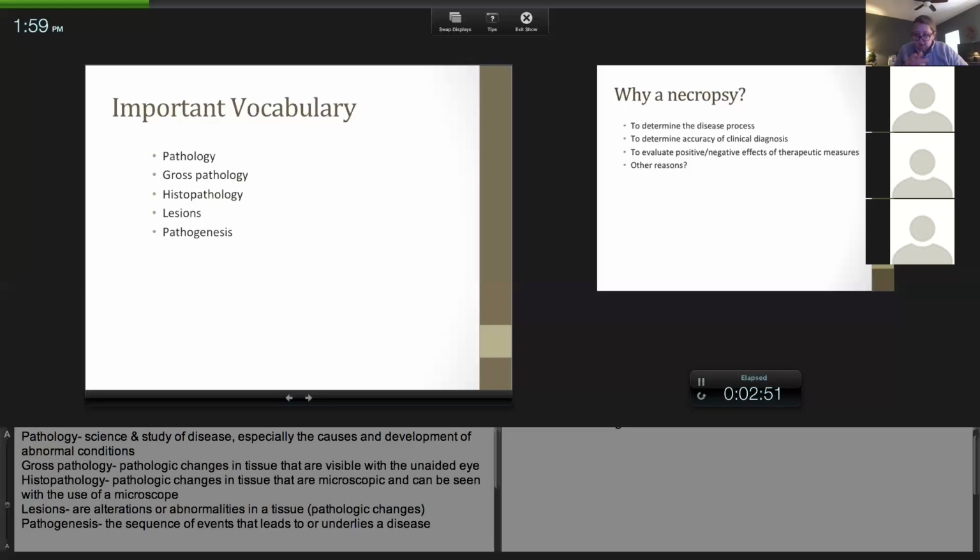Yeah, it was kind of dark red, brownish. Now some of your cadavers were a little altered, but normally if I open an animal, it should be a dark red, like a maroon color. And normally an organ like the liver or the spleen, the tissue should be smooth and of the same texture. But what if we open an animal and there's a bunch of yellow spots on the liver? Would I expect to see yellow spots on a liver?